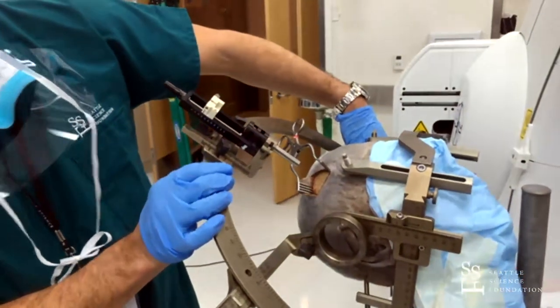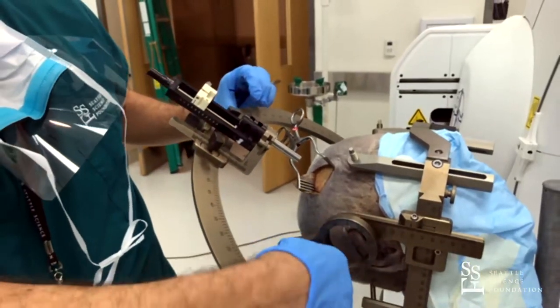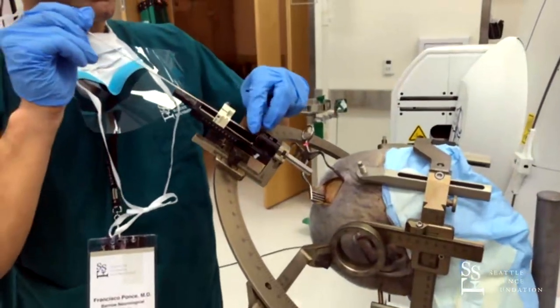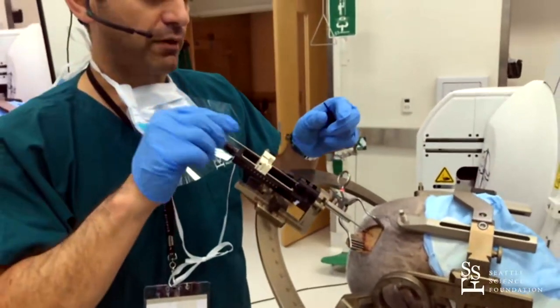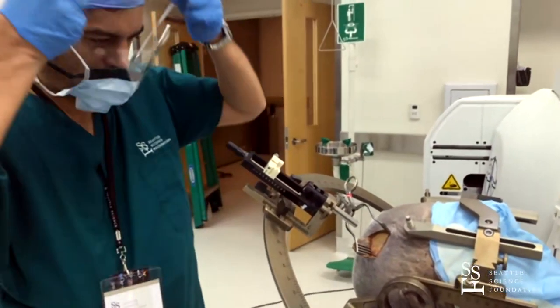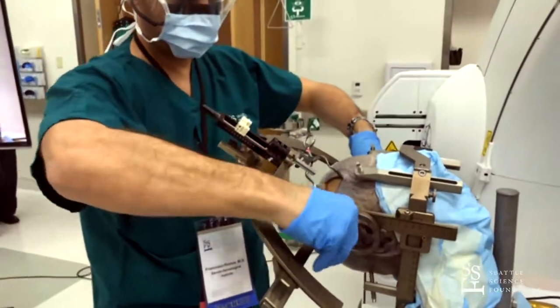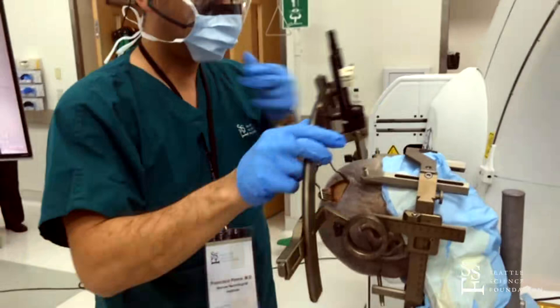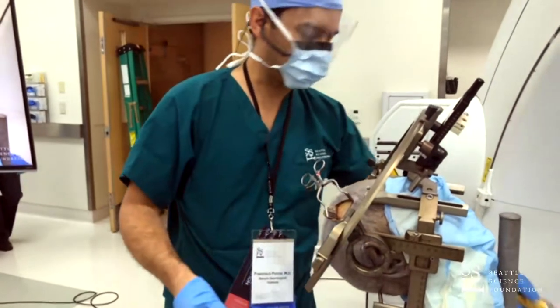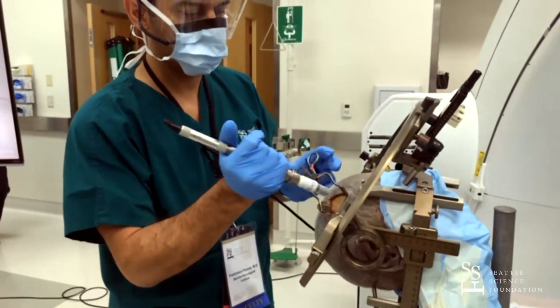We are going to be ready to reposition the arc to confirm our entry point for our burr hole. Ring is 51.3. We did this once to mark our incision, we did it again to mark our burr hole, and then we'll do it a third time to actually insert our cannula. So this will be the drilling part — protect my eyes and face from the bone dust.